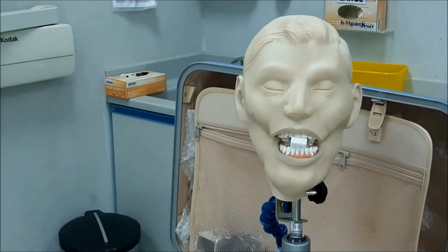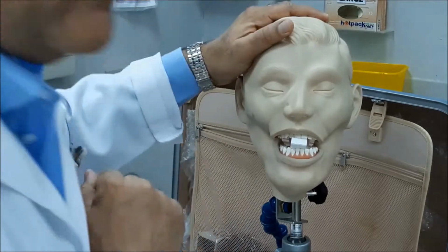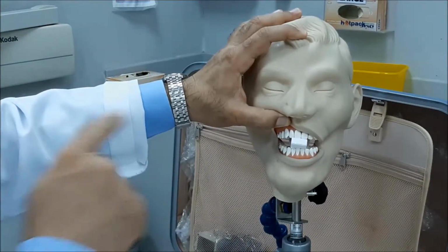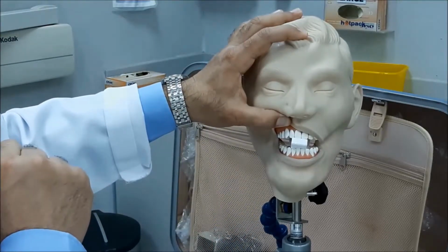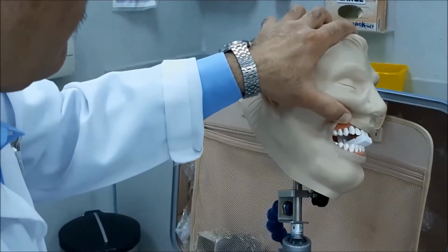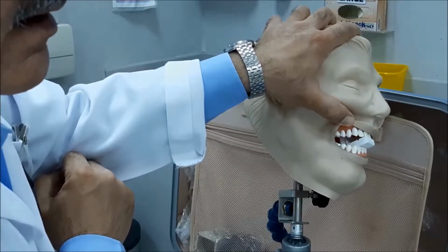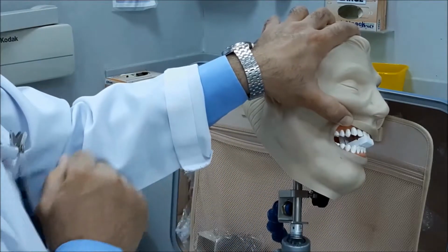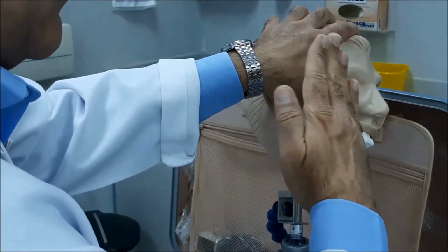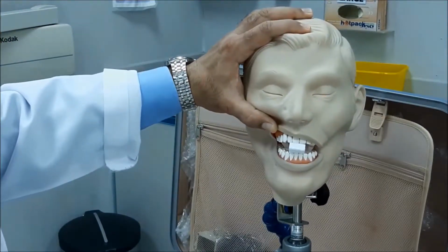So this is the radiograph for a central incisor. Just make sure that the sensor is placed behind the central incisors, and I will show you how it looks from the side. Tooth and the sensor. So this will also guarantee the parallel lines between the tooth and the film. And this is how it looks from the front.